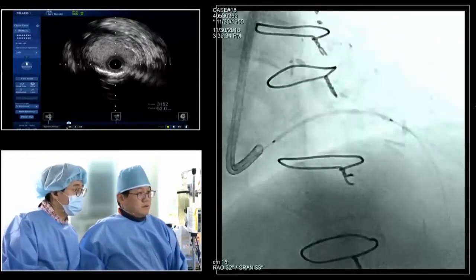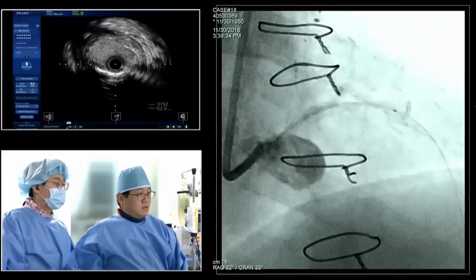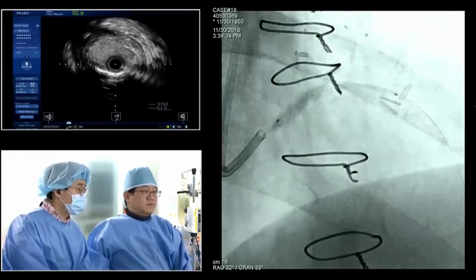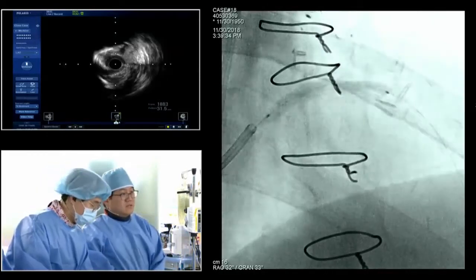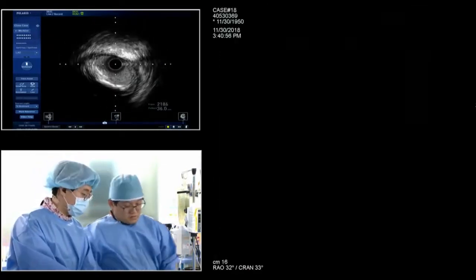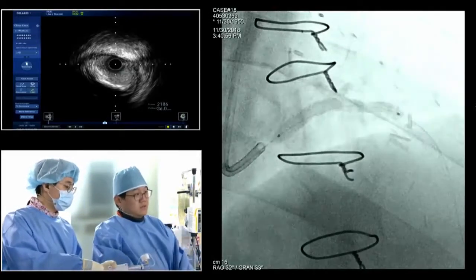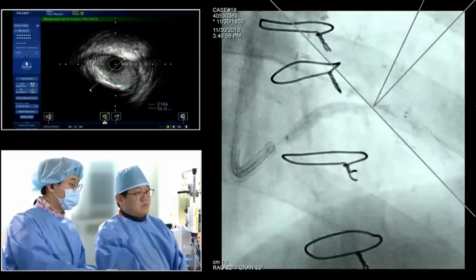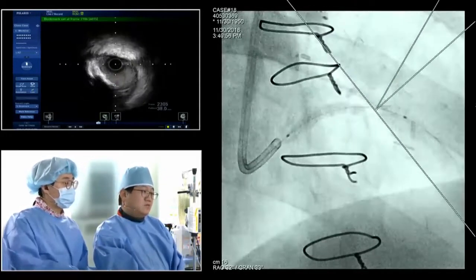First, the 10 inflation. But the first graft stent, the long-term patency rate is not good, and expansion is not good. So I have treated the LAD territory, the whole LAD territory. So a graft stent, I think, is not a good option.